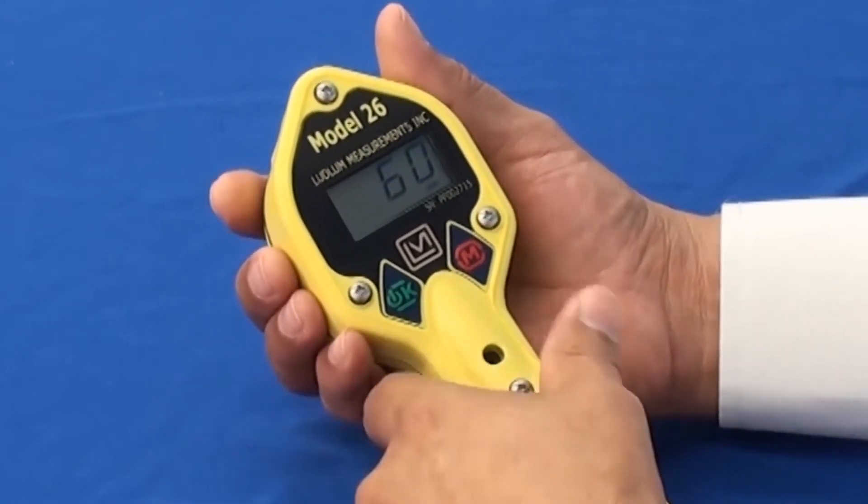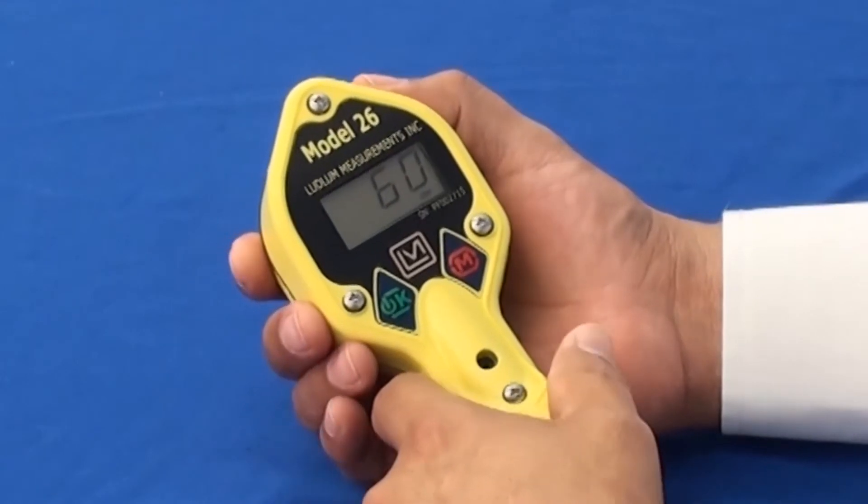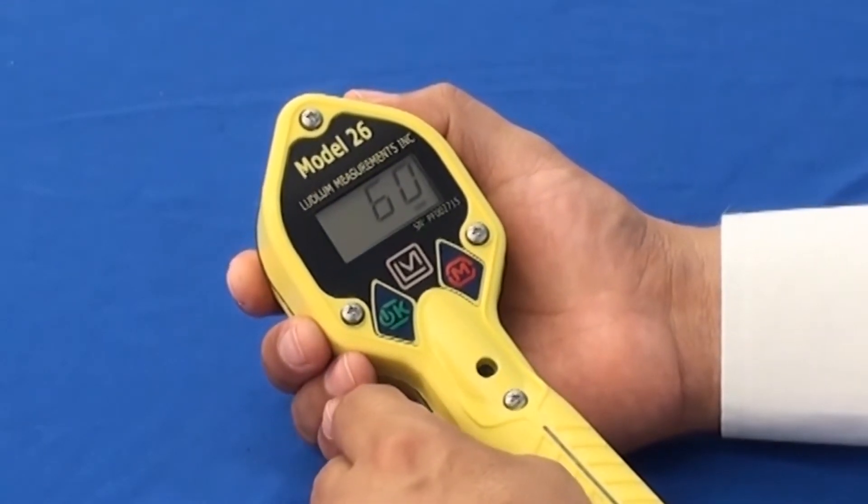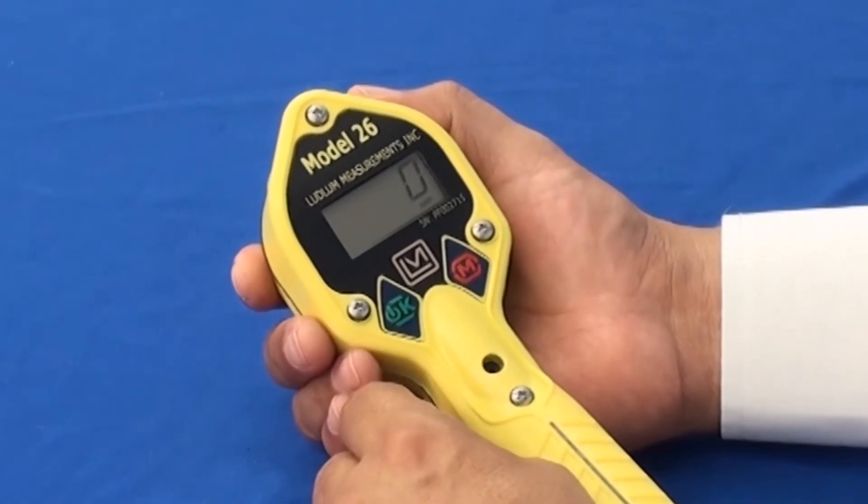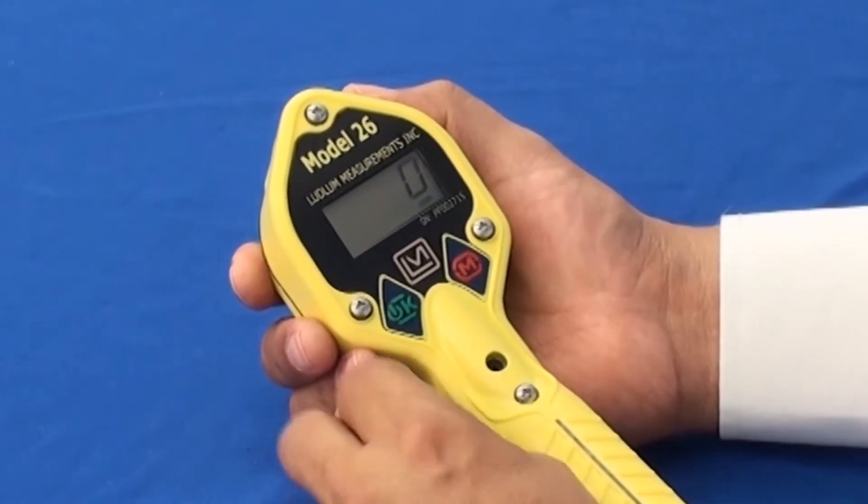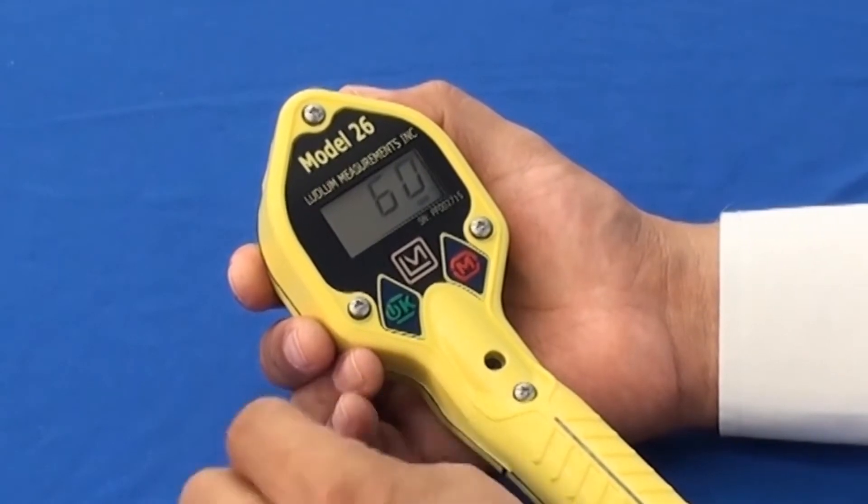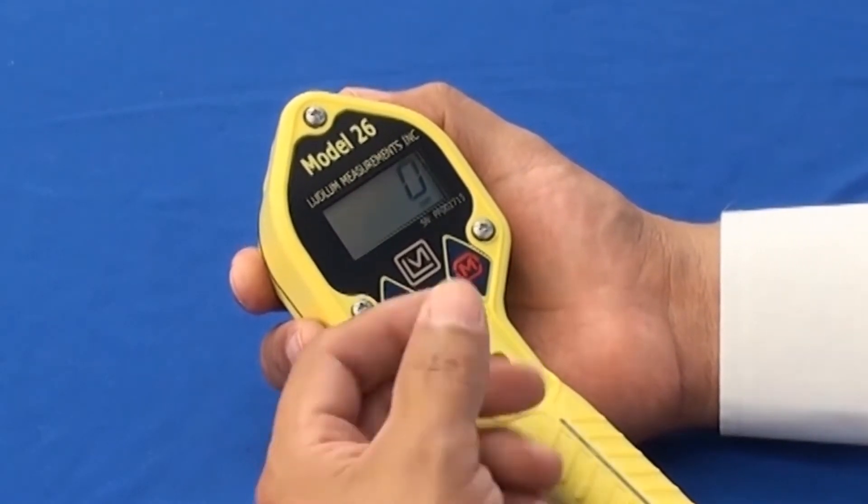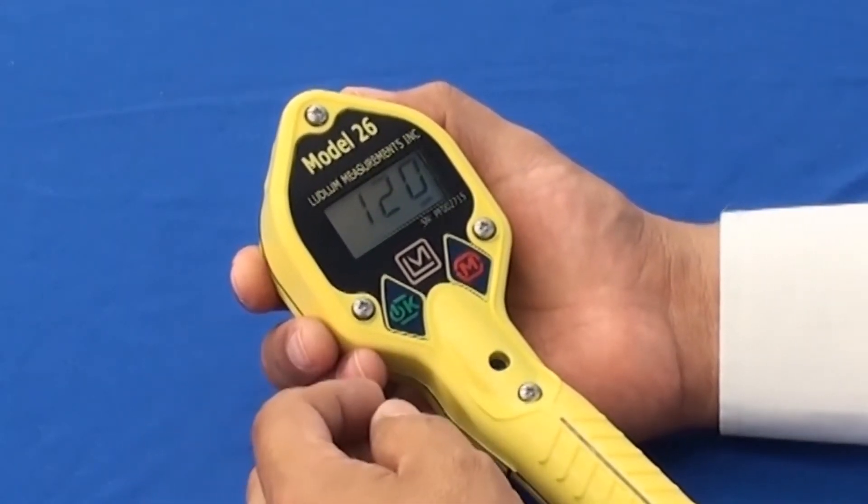Currently, we're reading out in counts per minute. The Model 26 has the capabilities of displaying either counts per minute or counts per second. I will show you how to manipulate the settings by way of getting into the setup mode.